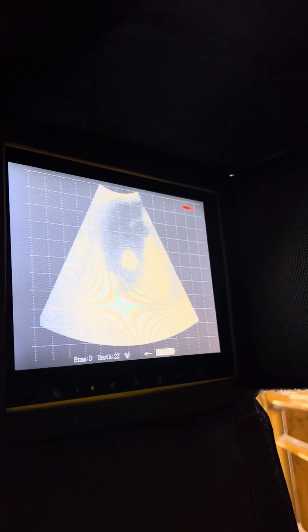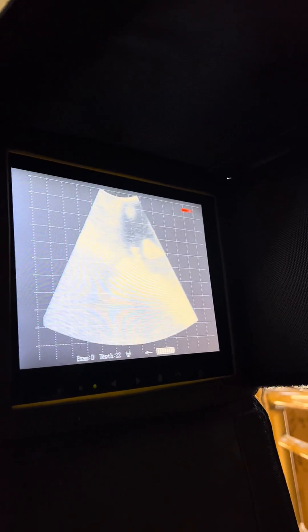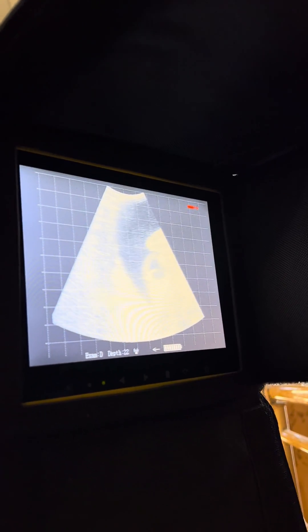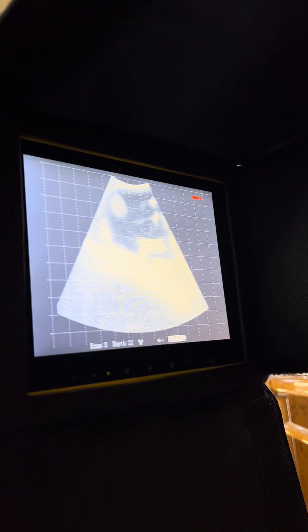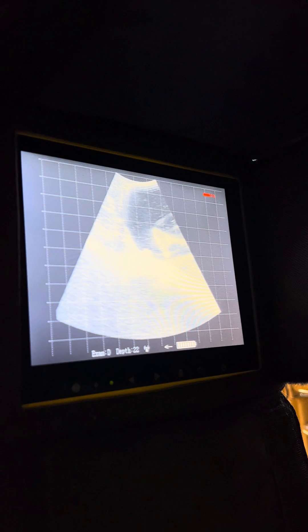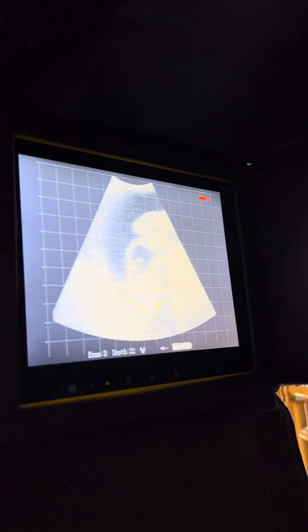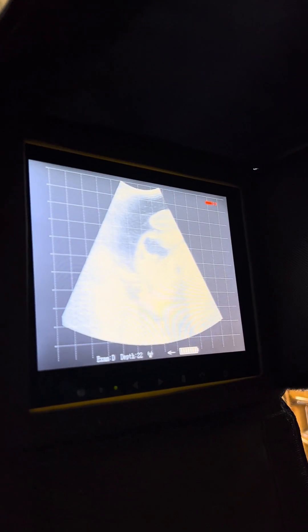Exam D is a really bright exam. This is for tough manure, really challenging days — bright sunlight outside, not covered, just challenging conditions. You can see it's just not as pretty; it's a very bright image. I don't use this often, but when you need that really high level of brightness, it's helpful to have. With Exam D you're at 22 centimeters deep.